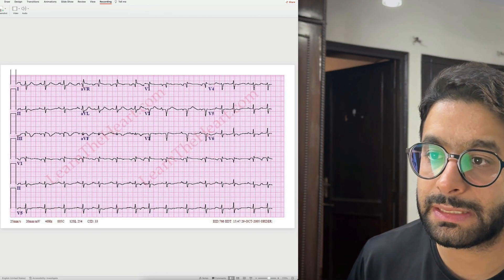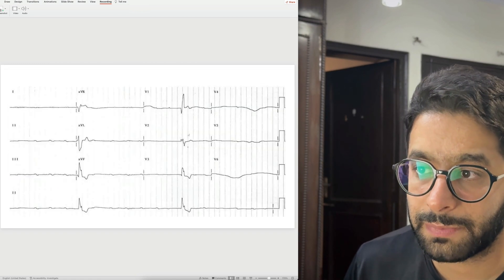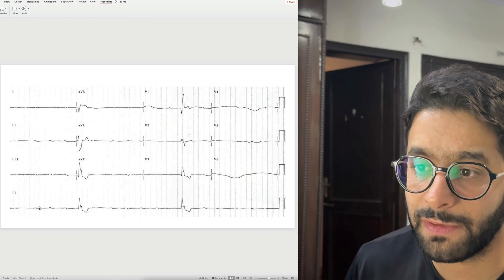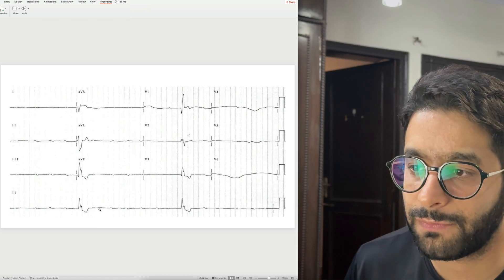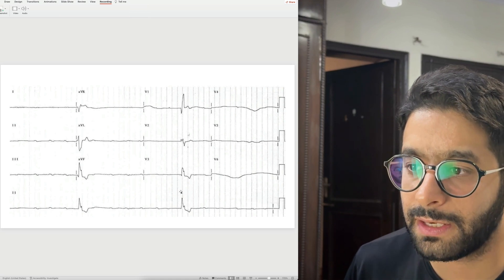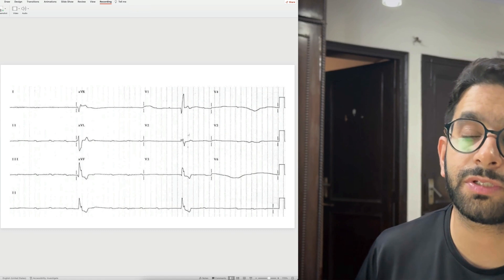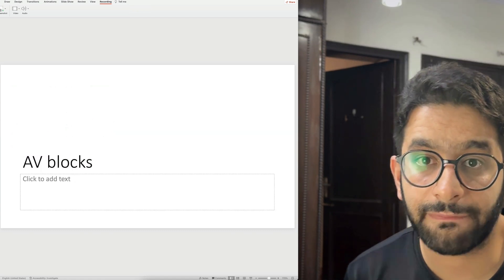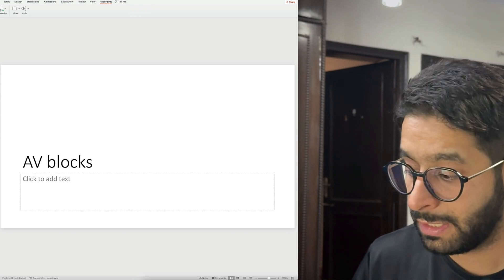Here's another example of complete heart block that's easier to appreciate: P wave — not conducted, not conducted, not conducted — then a ventricular escape beat. This patient has a very slow ventricular escape and must be having syncope. Unless an emergency or temporary pacemaker is placed, this patient may have asystole and die.